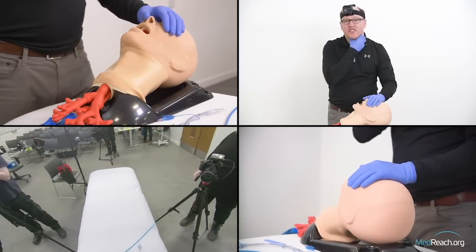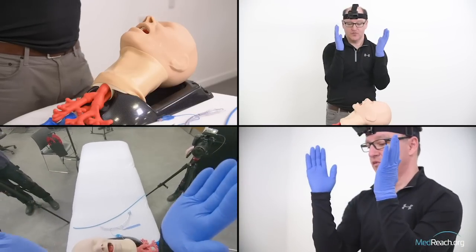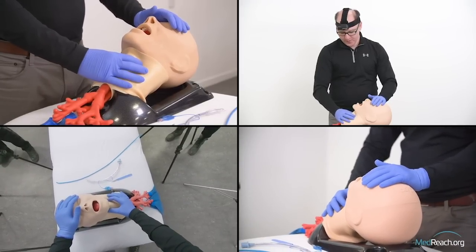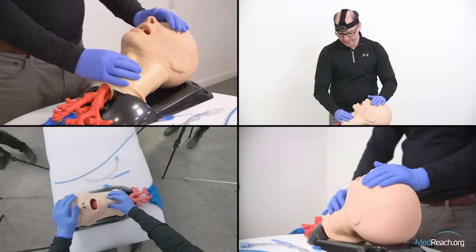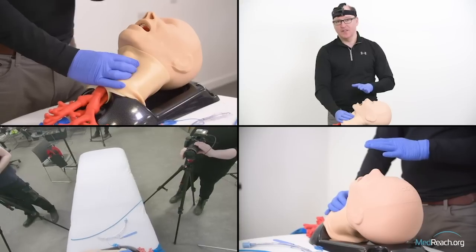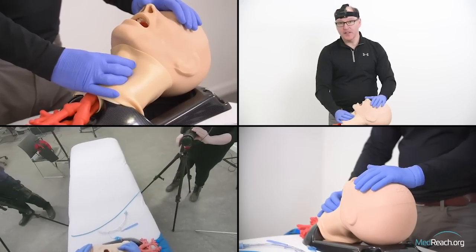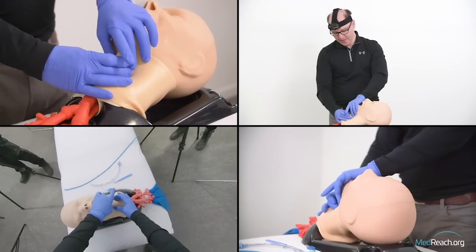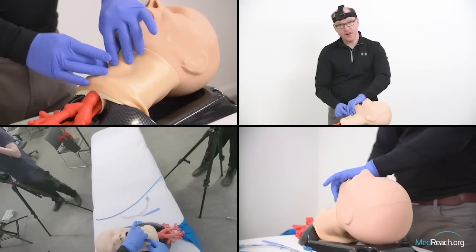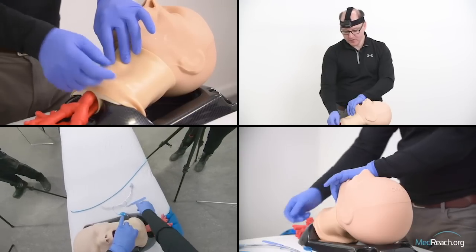We start with the laryngeal handshake, moving the hyoid, thyroid, and cricoid cartilage — this rhomboid set of structures. We rock the larynx from side to side, feel where the broad thyroid lamina is, come down a little bit, and here's the cricoid. I'm just rocking the rhomboid and identifying midline. I then stabilize with my non-dominant hand, using fingers one and three, because finger two is going to verify where the cricothyroid membrane is after I make the vertical incision.